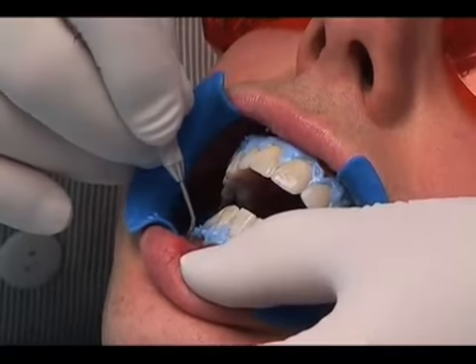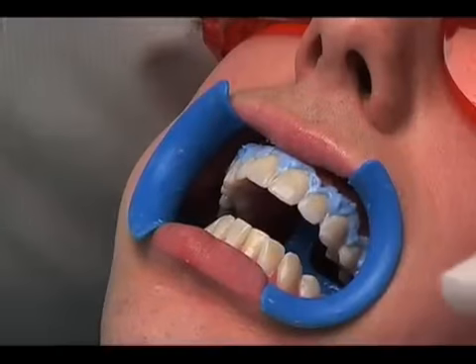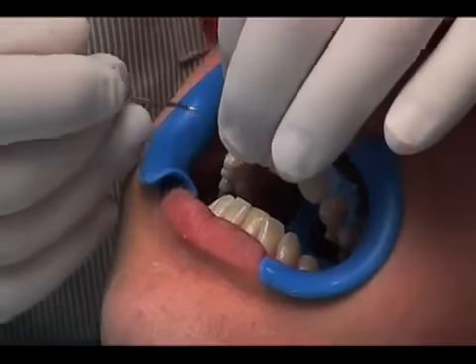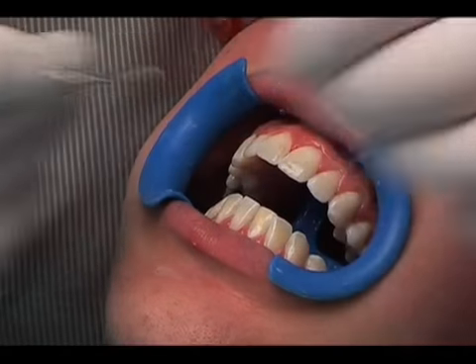Remove the gingival barrier by lifting it from one end using an explorer or other instrument. We recommend at this stage an after photo be taken. Discuss the outcome with the patient and the recommended next steps.